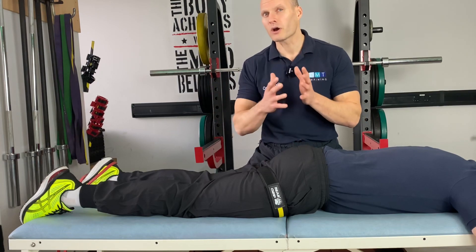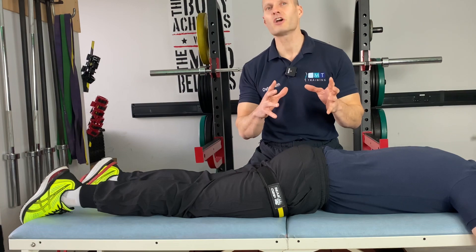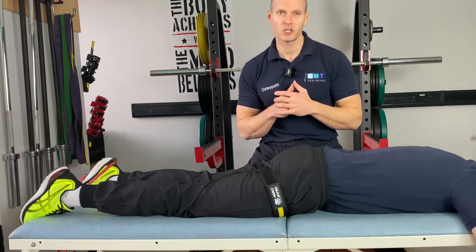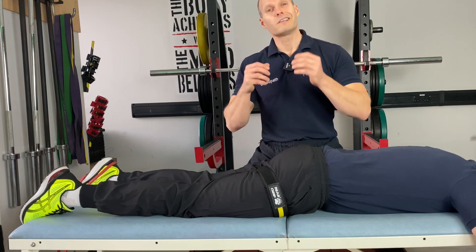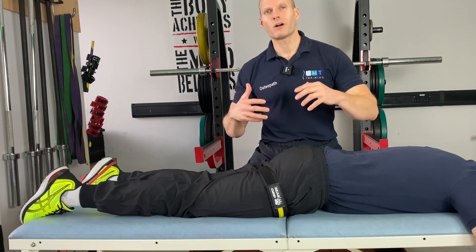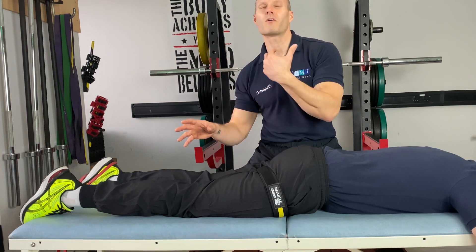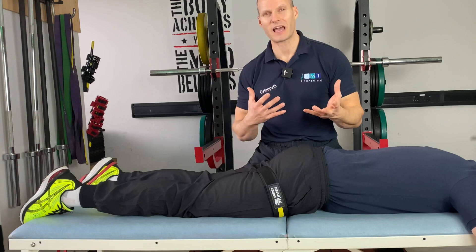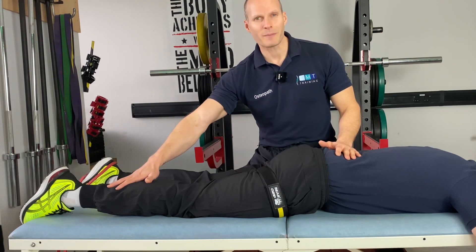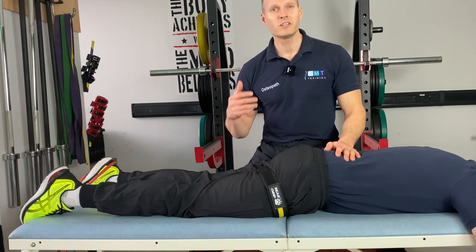With hypertrophy there's a following protocol: 30 repetitions as our initial pump set, followed by 15 repetitions for the subsequent three sets. Ultimately you are the expert in the room — there's no real specific right or wrong when using blood flow resistance within rehab. You're going to be patient dependent; if that means you only do 10 repetitions four or five times, that's absolutely fine.